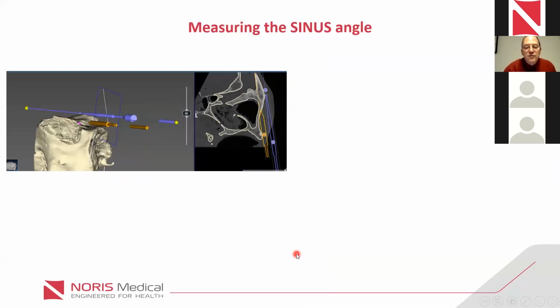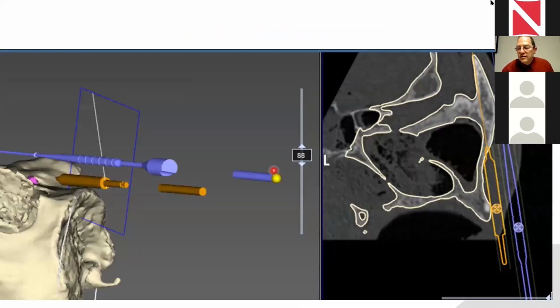We measure this height. If for some reason we did not go down enough, like we see here, then we will see a different distance between the measuring device and the diamond. You see the two red lines. The diamond didn't go far enough into the alveolar ridge, leaving us a very small line, meaning that we're too low and the implant is not going to the right position. Okay, we can know that.